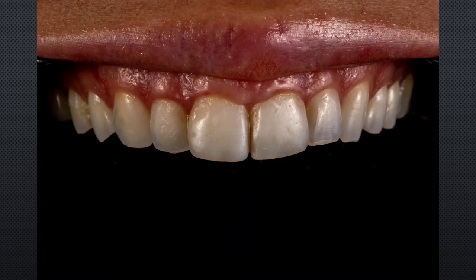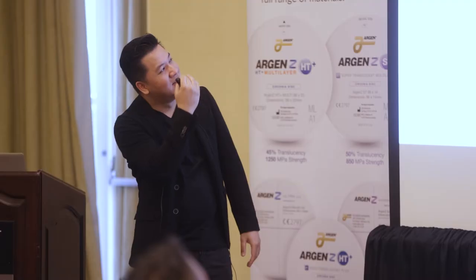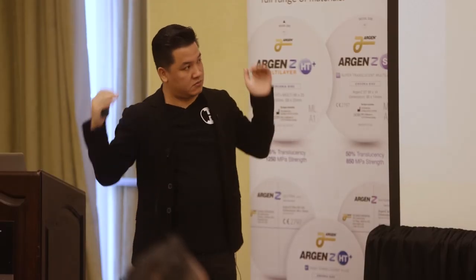So this patient here, her chief complaint, of course, is, I don't like how gummy my smile is. Very straightforward. So we address this, we take some pictures, we do a smile design, I bring it into the diagnostic, and I tell the doctor, looking at this picture, we thought maybe if I didn't have anything else, I could just lop off all of it, and we're going to do crown lengthening everywhere.